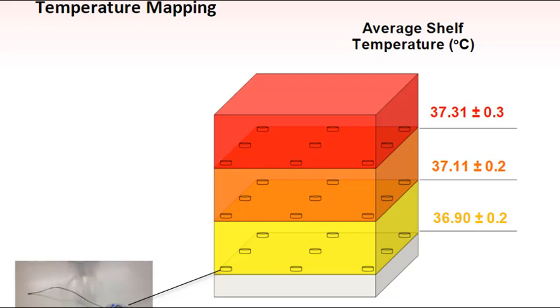Similar differences have not been reported between benchtop incubators, but that may simply be because no one has asked the question to date. Temperature within an incubator should always be monitored by a standardized external device.